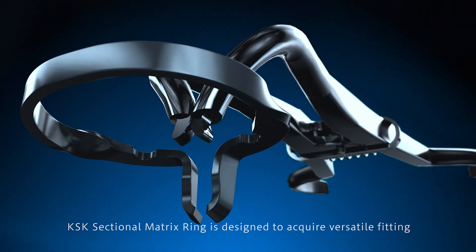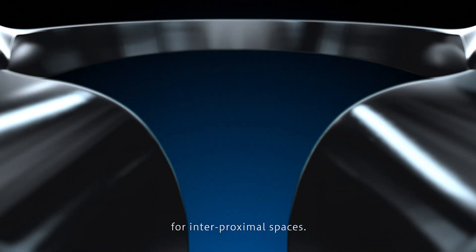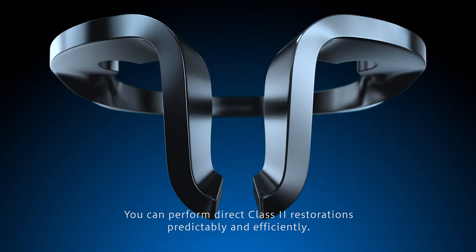KSK sectional matrix ring is designed to achieve versatile fitting for interproximal spaces. You can perform direct class 2 restorations predictably and efficiently.